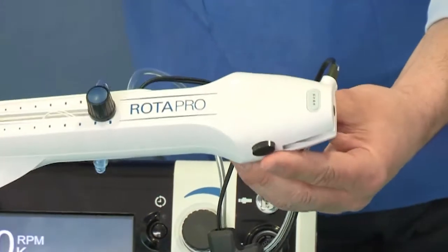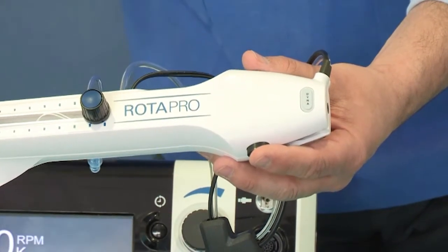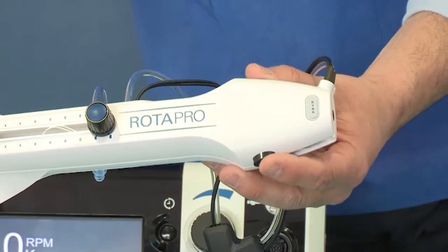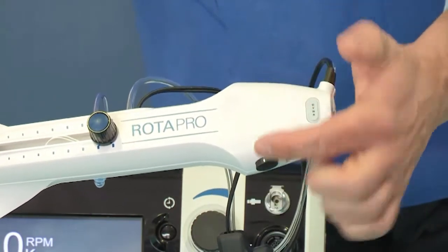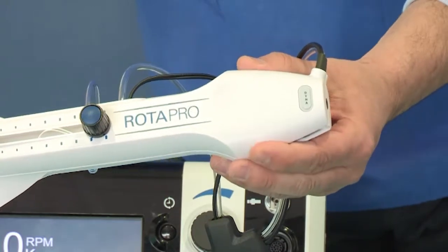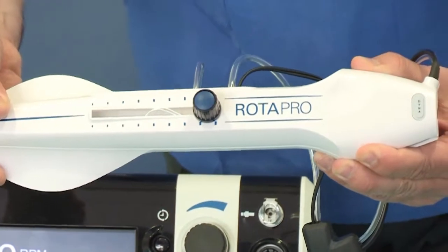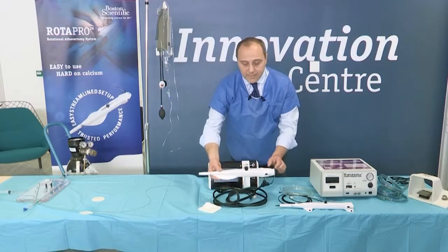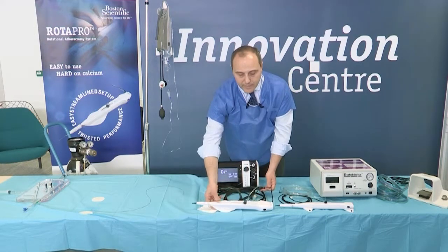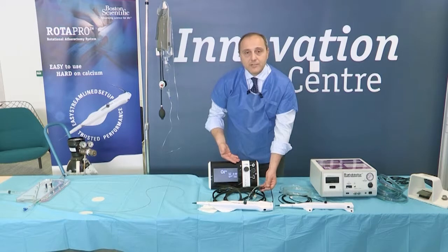So you can immediately see that it is much easier to move the rotor in Dynaglide mode and release the brake at the same time, as the two buttons have been put on opposite sides of the advancer. So by pushing the two together, we can easily pull back the device from the coronary artery and from the guiding catheter.